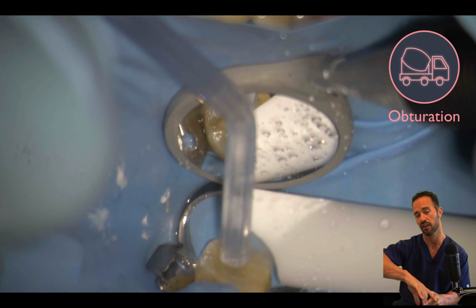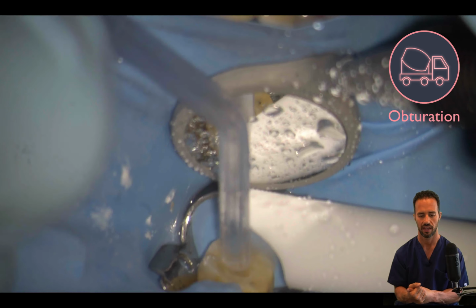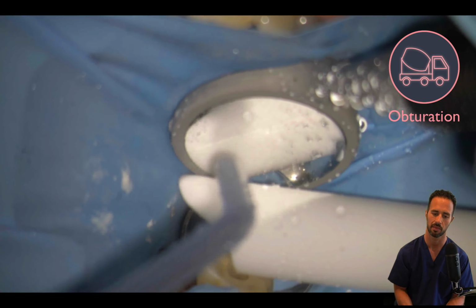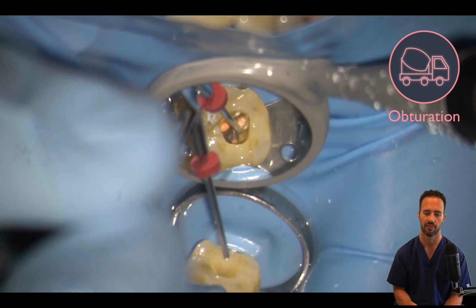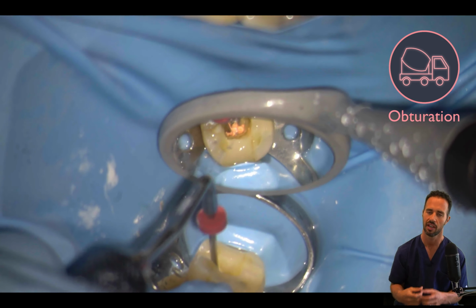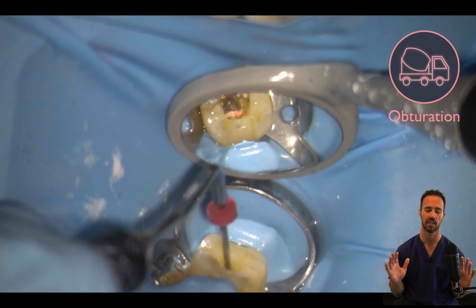Now we're just rinsing out excess sealer and gutta-percha flakes from inside. And we're using a lot of water, blasting it with the air and water buttons depressed at the same time. And we're going to go with our Buchanan plugger and eventually with a paper point and maybe a cotton pellet just to clean up internally. You want to have a nice, neat, finished product here. But our obturation is essentially complete.